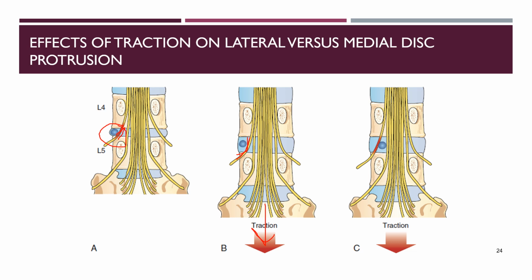Whenever you have this kind of medial protrusion, you can see that once this traction force is applied, now it's actually causing more compression here. So again, this could lead to your peripheralization of symptoms, or it could lead to that complete loss of pain, which are both bad. So medial versus lateral protrusion would be something that you may see.